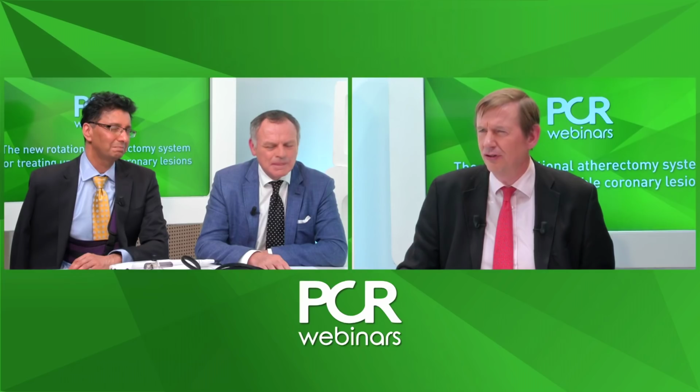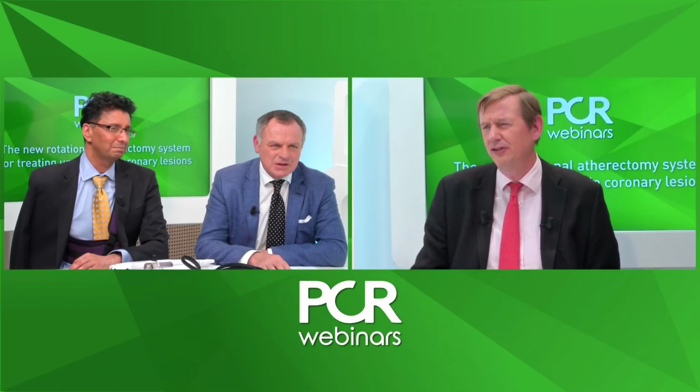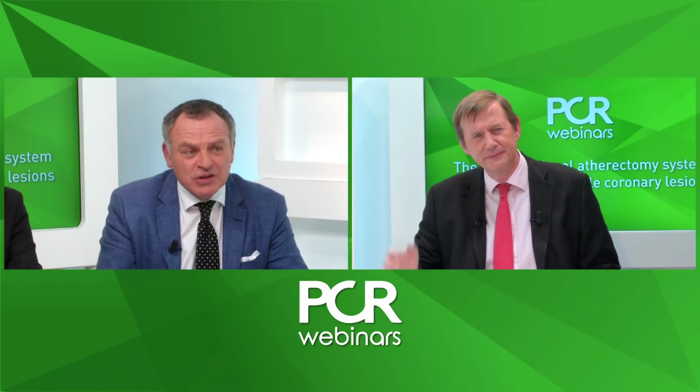Just another comment, perhaps, the cutting or the scoring balloon has been mentioned. Briefly, let's say, when might you use those to facilitate the stent deployment? Okay, I will use it most of the time in a fibrotic lesion, for example, and the other situation is a very short calcified lesion.